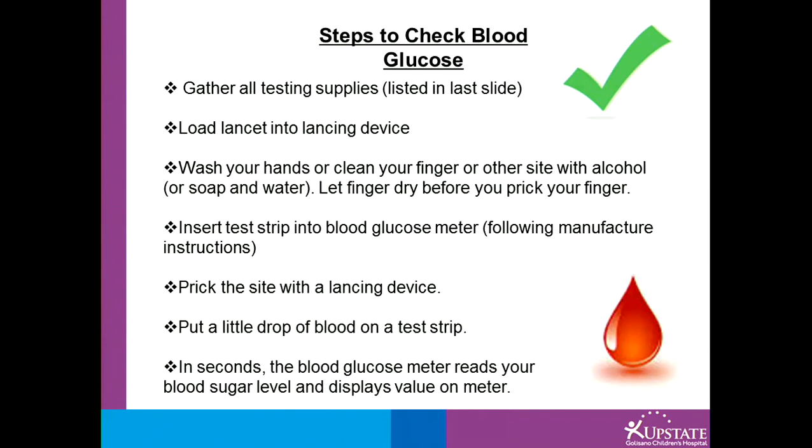Steps to check your blood glucose: first, gather all of your supplies. Then load your lancet device with the lancet. Washing your hands is very important, either by using an alcohol swab or using soap and water, and making sure your fingers are dry before you prick.